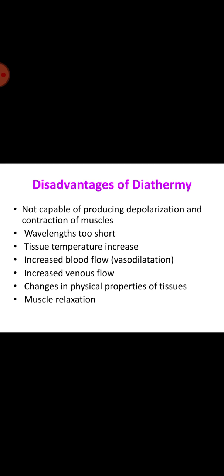The separation of tissues by electric current always takes place immediately in front of the cutting edge and is not caused by it. Electrical cutting therefore doesn't require any application of force. Instead, it facilitates elegant and effortless surgery. The electrode virtually melts through the tissue instantaneously and seals the capillary and other vessels, thus preventing contamination by bacteria.